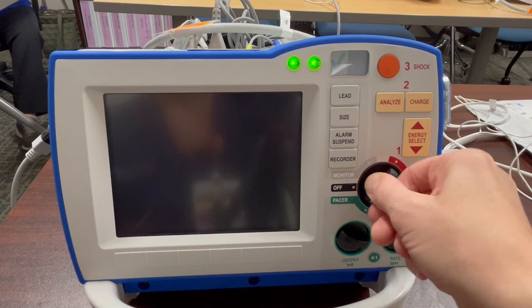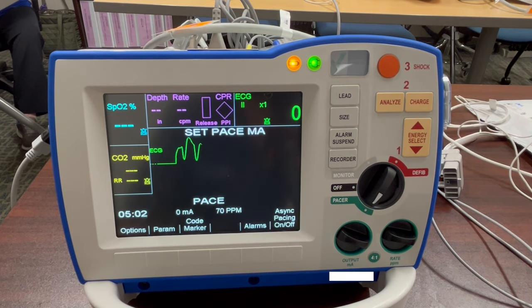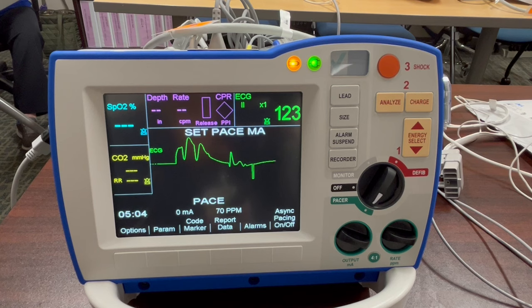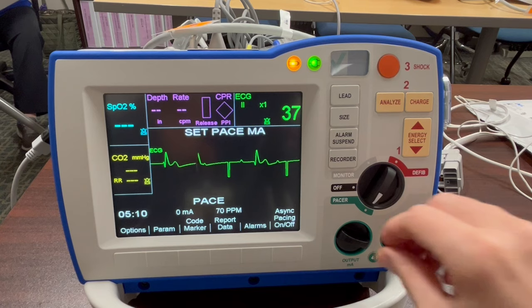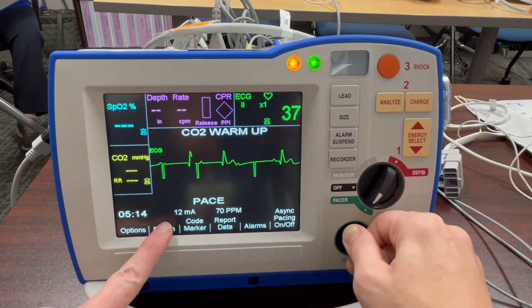To pace your patient, turn the device onto Pacer mode and use this knob to increase the milliamps. A normal capture is usually around 60 milliamps. Once you reach the pacer threshold — meaning you see the pacer spikes — it is good practice to increase the milliamps by about 10%.